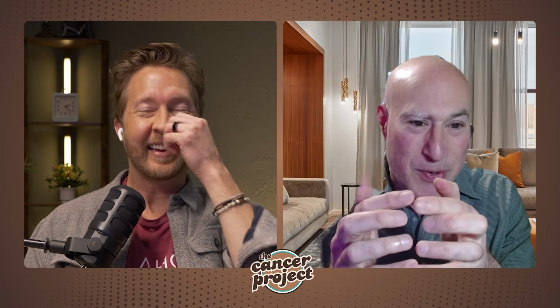Right. So first, let's talk about photons. You have this MLC. I'm going to use my little flesh MLC here. Let's say you have a little spot, so my fingers are lead or alloys that are blocking the radiation. Then you have this open little spot. Well, if I give dose there, I can give a little bit, or I can give a lot.